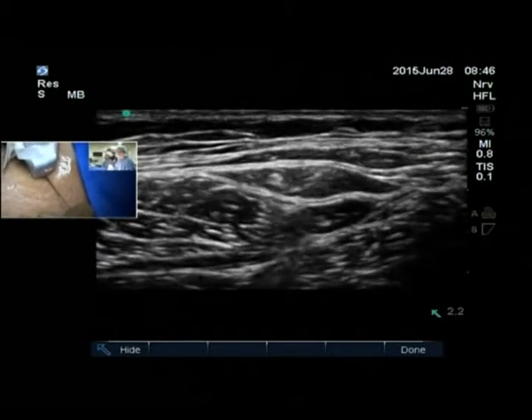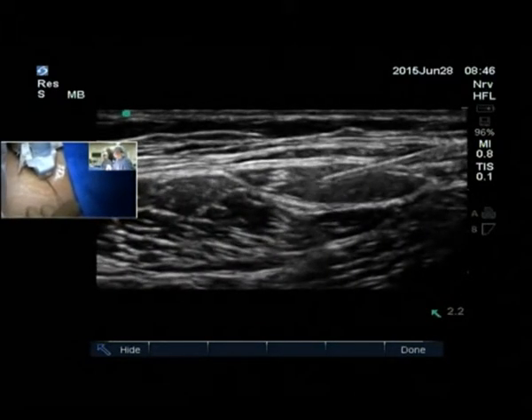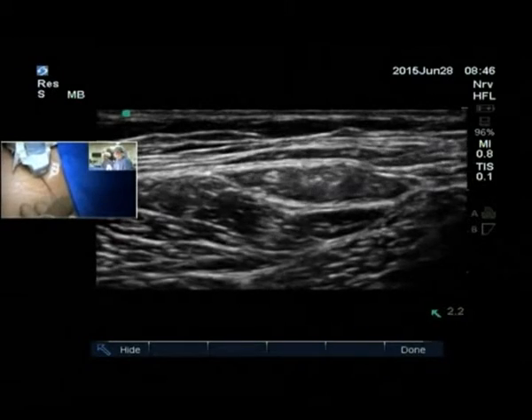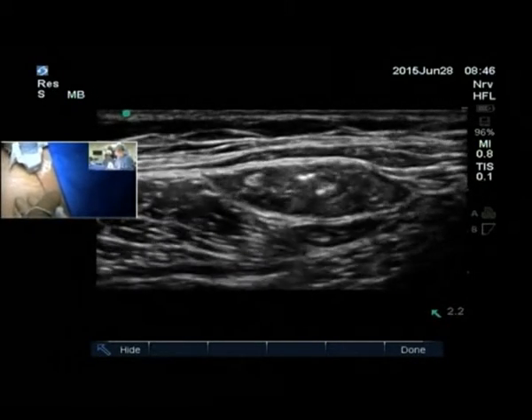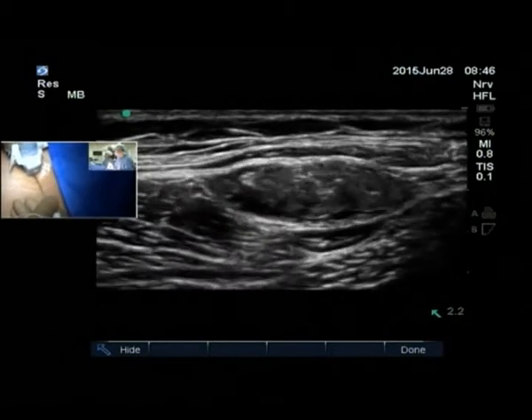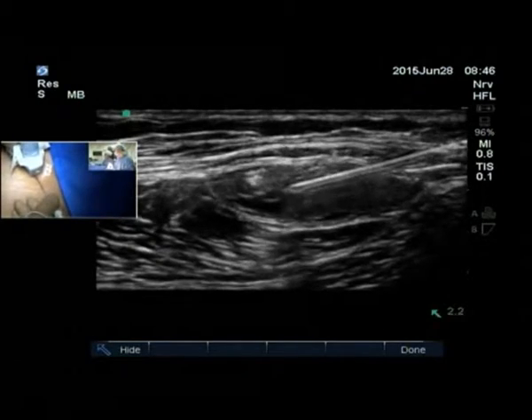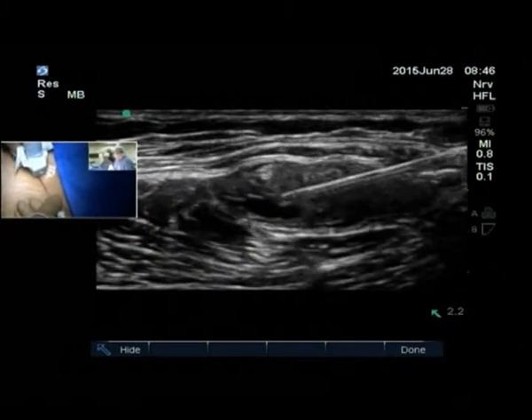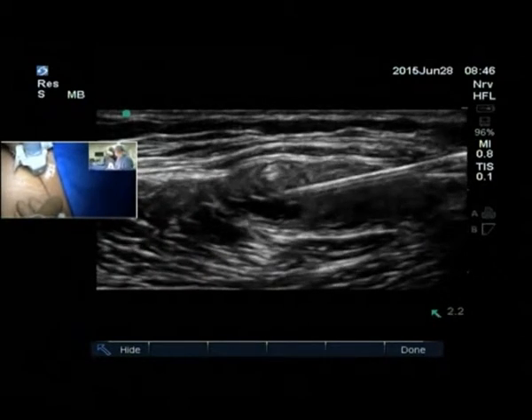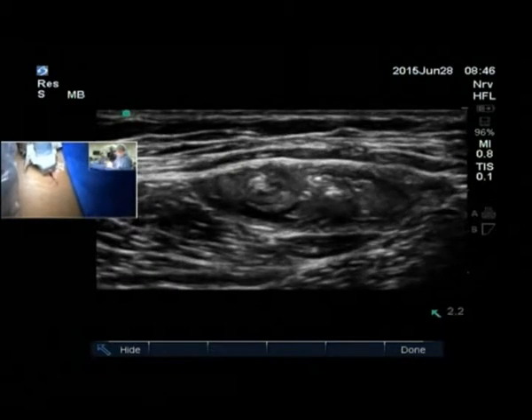So can you inject half a cc? That's good. Okay, so we can inject 3 mils there, and then that's all we need. This is called a cloud sign. When you inject it, the local anesthetic, when it is agitated, produces a small cloud. So my needle is nowhere close to the nerve, it is in a puddle of collection of local anesthetic, so I know I'm very safe. Done. So that's a lovely demonstration.